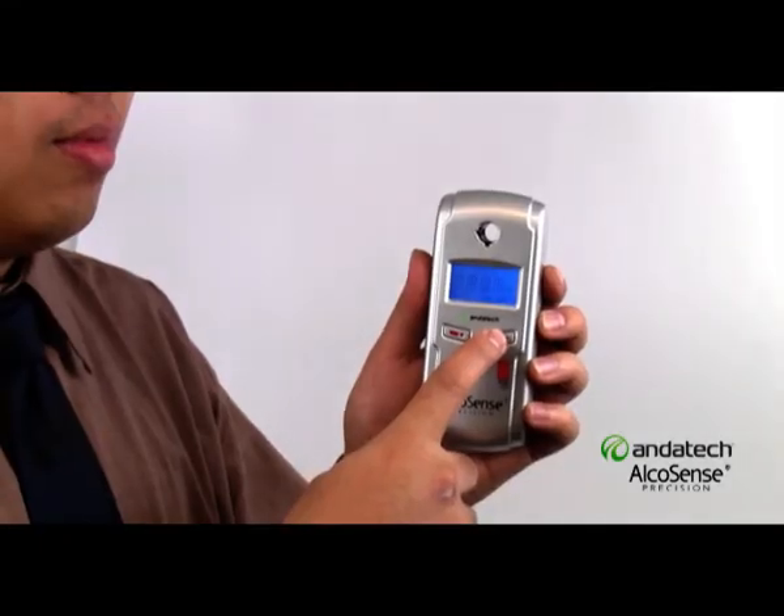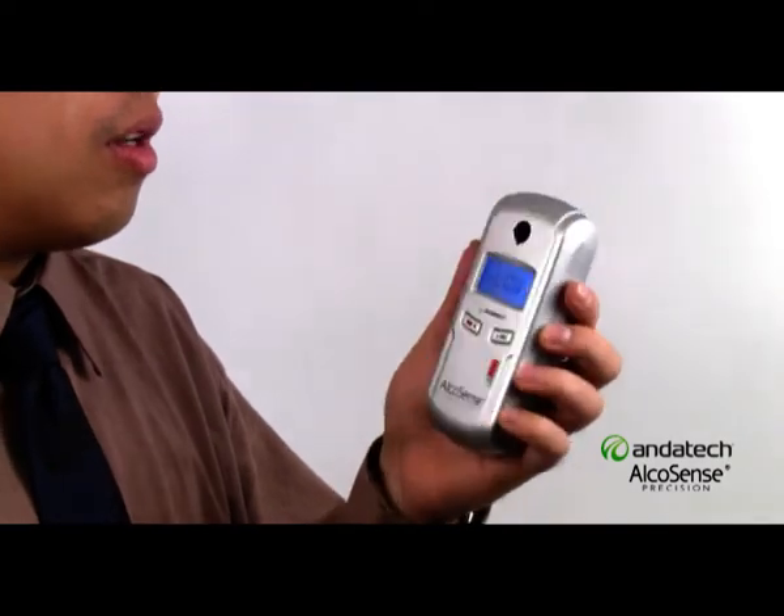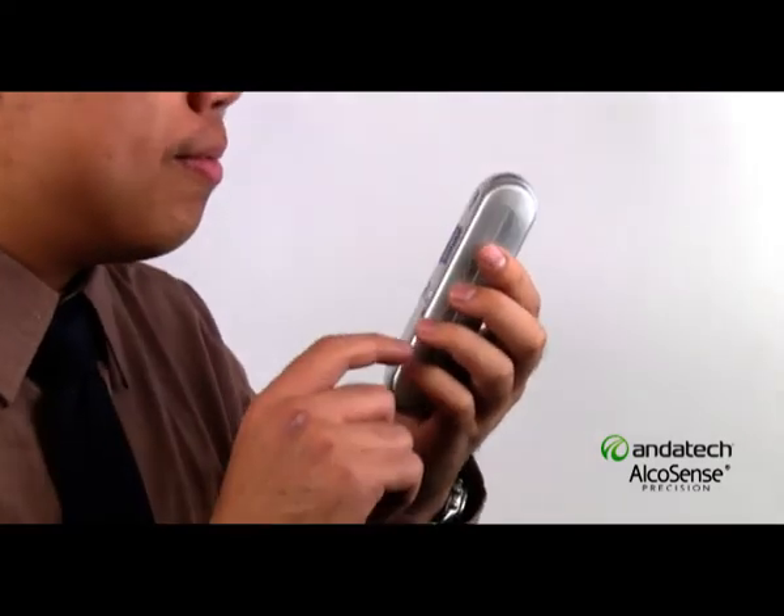The AlcoSense Precision features passive mode. Simply turn on the unit, wait for the screen prompt, and speak into the mouthpiece opening.